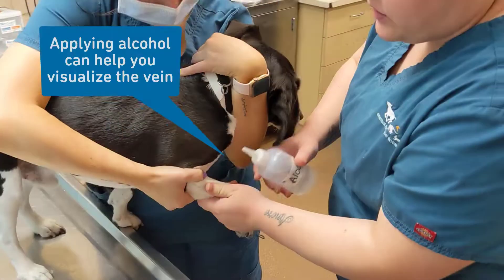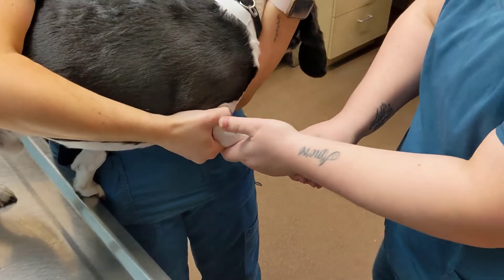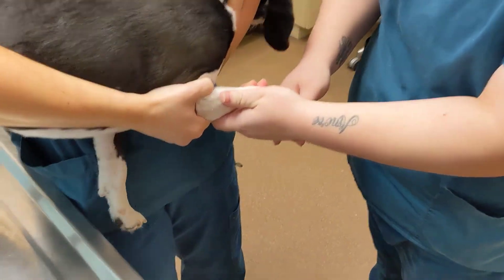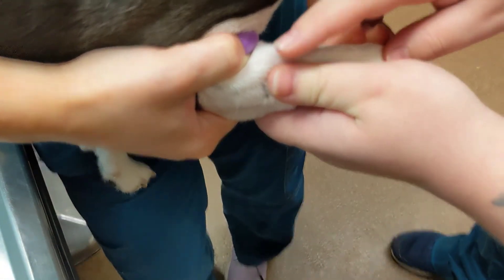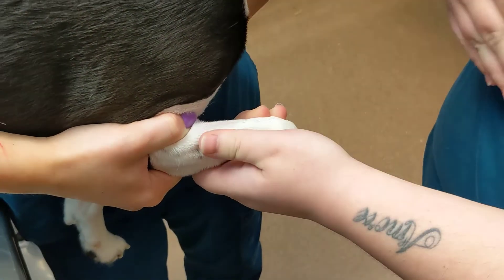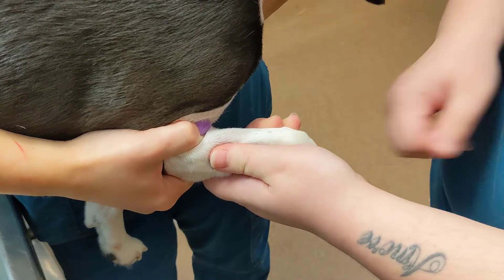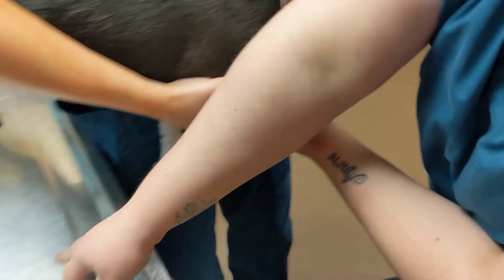We're doing a blood draw on this little guy — he needs a heartworm test. The cephalic vein is on the front leg, and Erin is holding off very nicely. You can see the vein kind of pop right here. In dogs that have shorter legs, like beagles, bassets, and dachshunds, you'll see that their veins kind of curve, so that's something you want to watch out for when doing a blood draw.